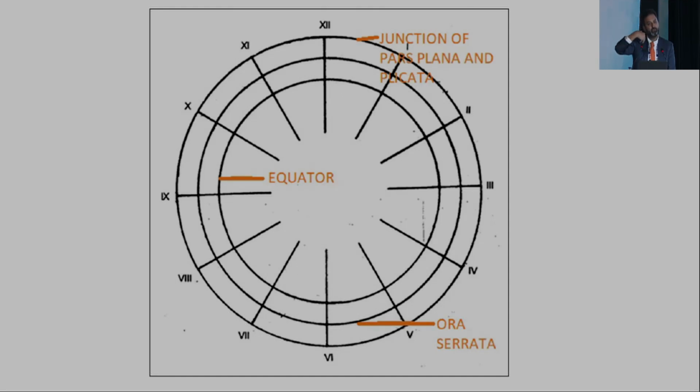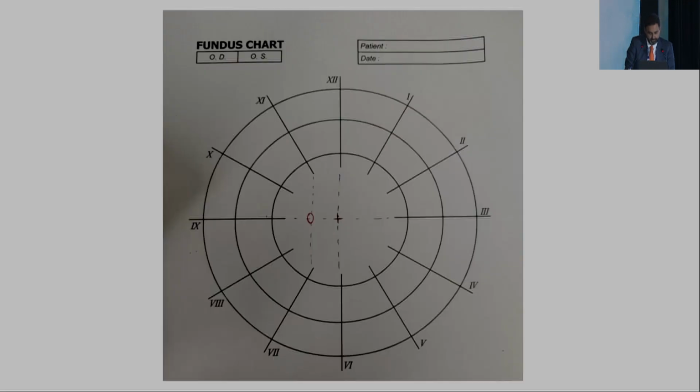You have certain uveal pathologies that might arise from that area. You could get ciliochoroidal detachments secondary to certain retinal pathologies. So all of those will be seen there. You could have microcystoid degenerations and other things, and you might want to show them there. So hence these three: the innermost circle, the middle circle, and the outermost circle, right?